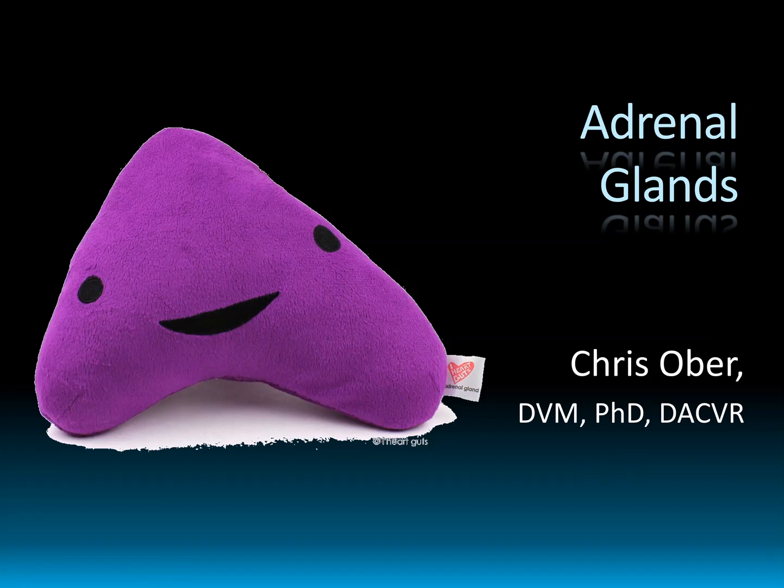You should be able to tell what this lecture is all about without reading the title, but just by looking at the big purple blob on the left side of the screen, because that is most obviously an adrenal gland. So that's the topic of today's discussion. And I will say that that is a human adrenal gland, or at least approximately the shape of, perhaps not the consistency of, a human adrenal gland, but it's actually a pretty close representation of a right adrenal gland in a dog as well. So it pretty much still works for our purposes.